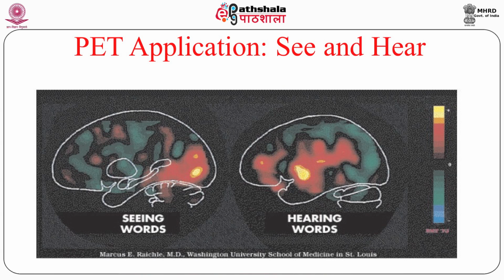It so happens if a person is in tension and you take an image, you can find there is a problem, though it may be normal, because some parts of the brain get active. That is the reason whenever the scan is done, the patient has to be asked not to remain active and to sit quietly at one place, so that there is no active area in the body which we could confuse with cancerous cells. Normal active cells which are more active can also absorb more fluoro-18.